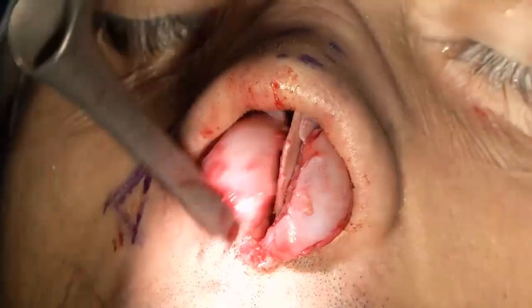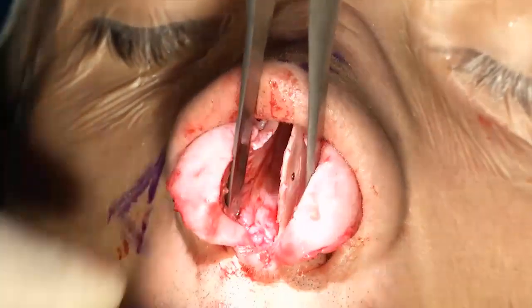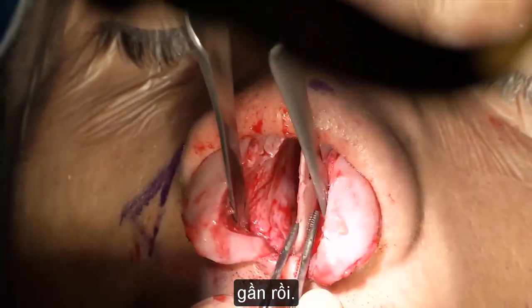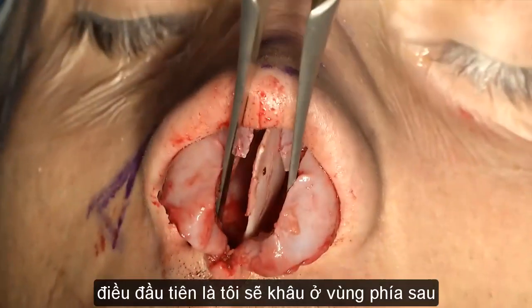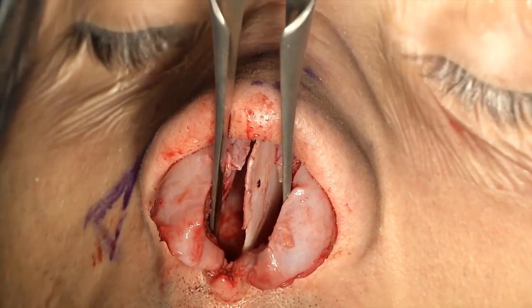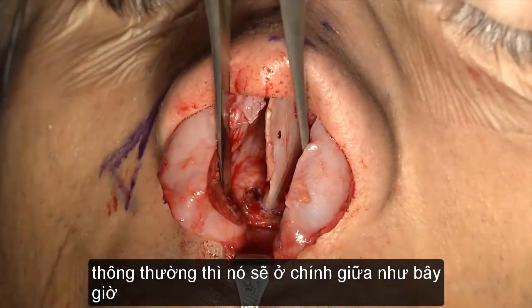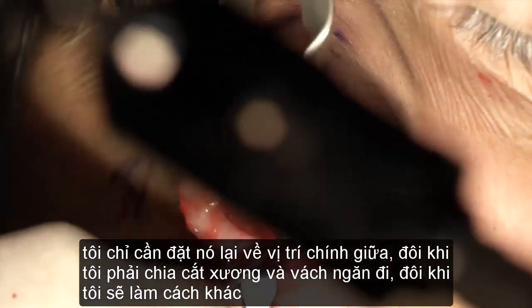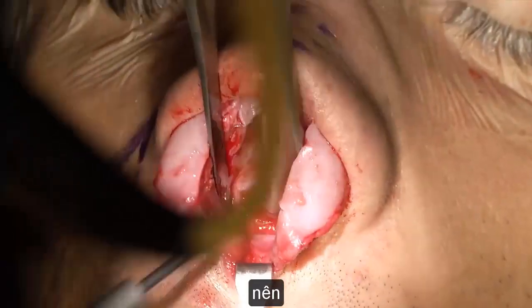So, yeah, now that took care of it. Now this cost me disinserting the spine here. No, well, almost, but I'm not going to trust it. So, first thing I'm going to suture it back, yes. Yes, later, give me the electric. So you see the nasal spine here. Sometimes this thing will just fit in the middle, like this time. I just need to put it back in the middle. Sometimes I will split my spine, sometimes I will do other things.